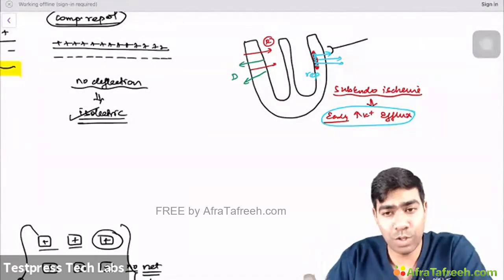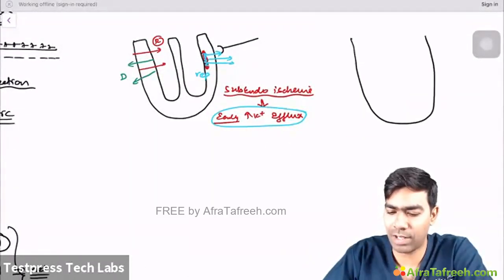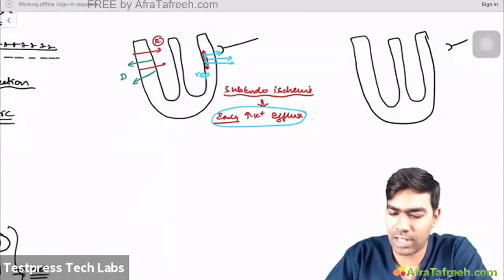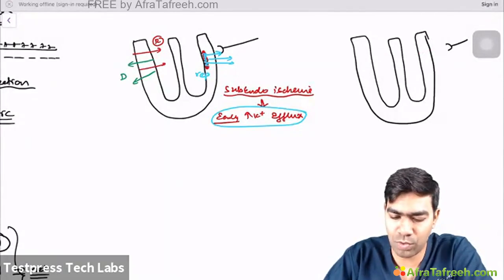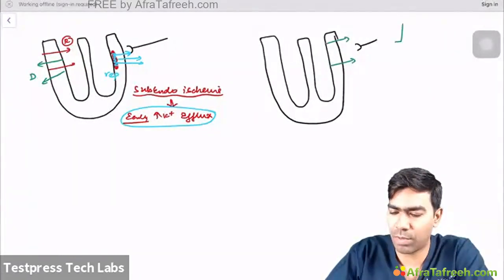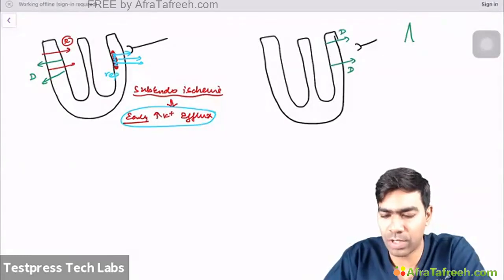So basically, why should you get a positive T wave in the first place? For that, you need to understand another way. Suppose you take a lead here, and your depolarization moves from endocardium to epicardium. This should create a positive deflection in the form of a QRS complex. Let me draw a QRS complex here. This produces a positive deflection because this is a depolarization wave moving towards a particular lead.